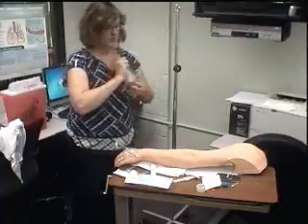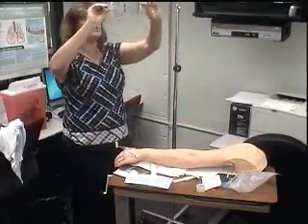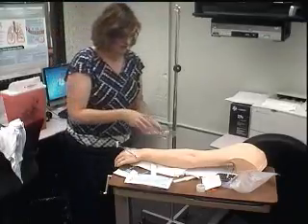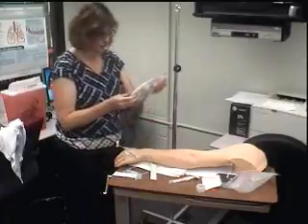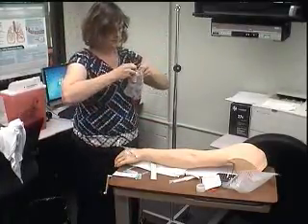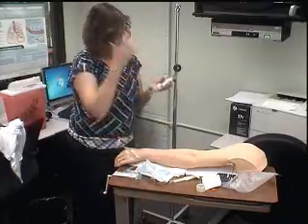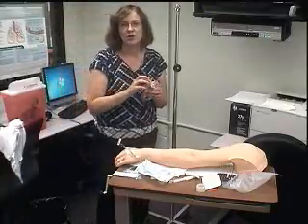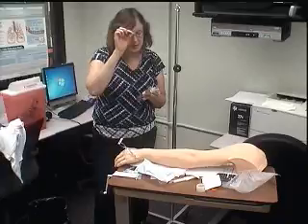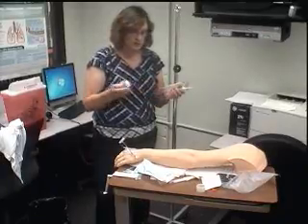Once I've got my fluids opened, I'm going to look to make sure the fluids are clear, there's no sediment in there, there's nothing that looks wrong with it, it's not leaking, it's all intact. Then I'm going to open my tubing up. These rip open also. This was 10 drop tubing. You may have 10 drop or 15 drop, which is macro, or you could have 60 drop that's got the little tiny drops, which are 60 drops in an ml tubing. This is just 10 drops.